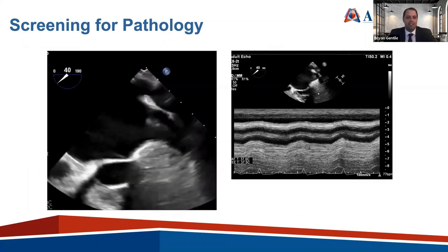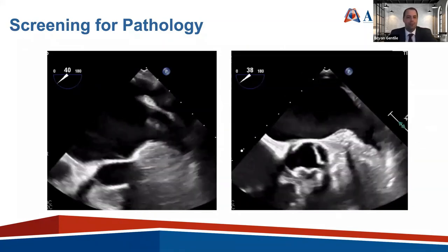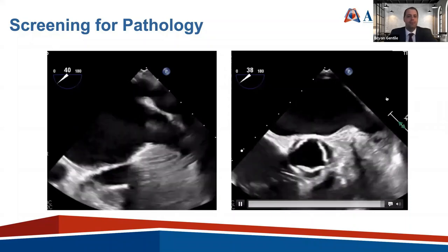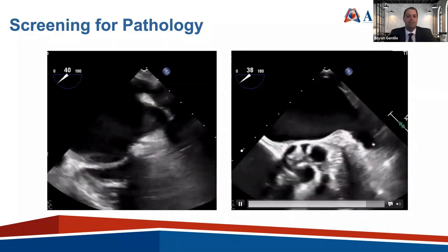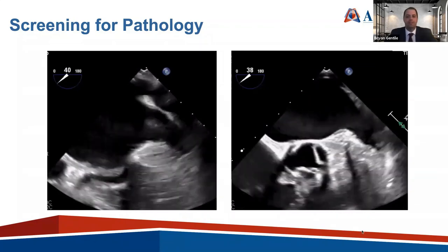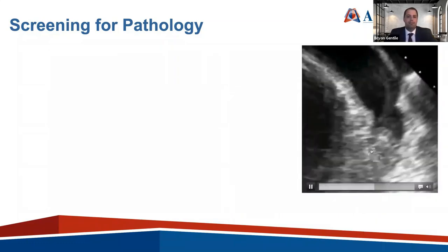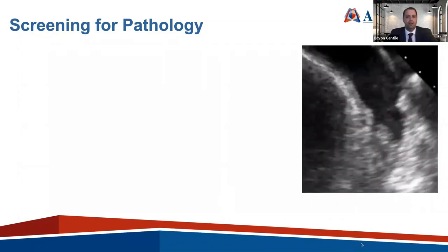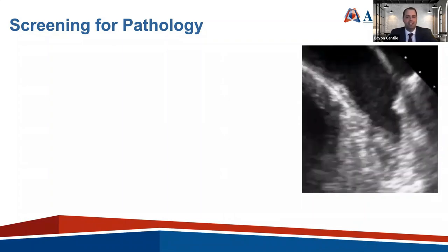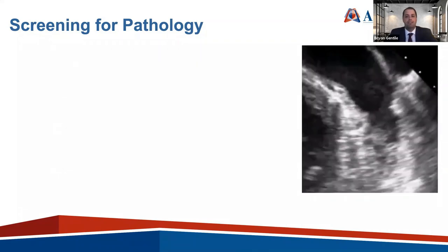A good teaching technique to exclude thrombus in ambiguous situations is to advance the probe a little further, provide more anteflexion, and move the atrial ridge to the right side of the screen, allowing visualization through the body of the left atrial appendage. Here's an example of a true thrombus within the apex of the left atrial appendage in a patient with amyloid cardiomyopathy. In our lab, we would not approach this patient for percutaneous closure due to the risk of embolizing the thrombus.